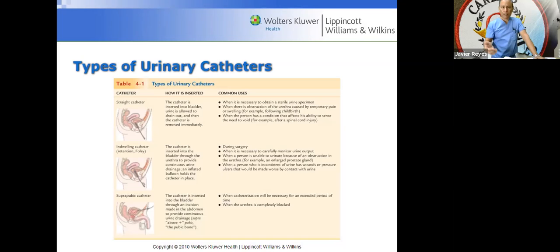I do have a resident who has what we call neurogenic bladder. Neurogenic bladder means that the nerve that stimulates your bladder to contract and empty itself doesn't work anymore. So the bladder will never empty itself. So what do we have to do? We have to go in there and catheterize him. We just say cath because it's easier. We go in there and cath him or her, and empty that bladder. That's a straight catheter, or we also call it an in and out catheter.